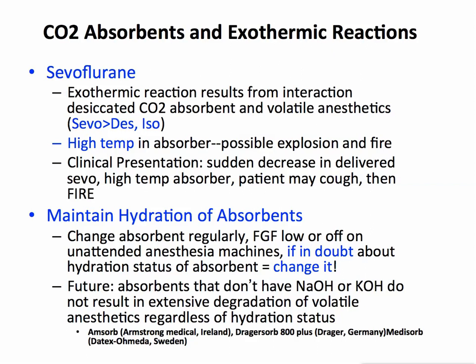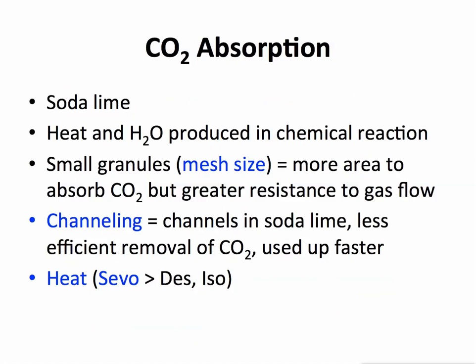If you're worried about the hydration of your CO2 absorber, and for example, you come into a room where someone left the fresh gas flow on over a weekend at 10 liters per minute or something, remember, just change out the CO2 absorber. Don't try to hydrate it with water or anything. And in the future, we may not have to worry about this when we don't have the sodium hydroxide and potassium hydroxide that degrades our volatile anesthetics.